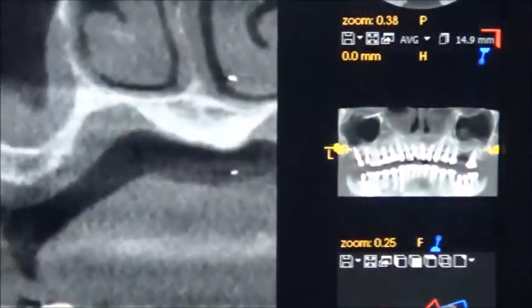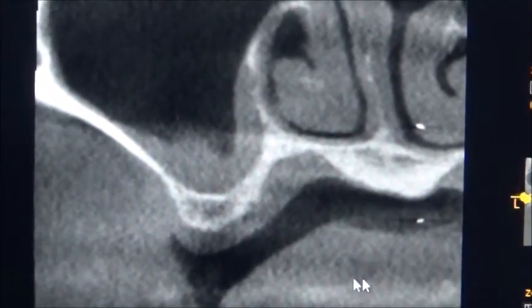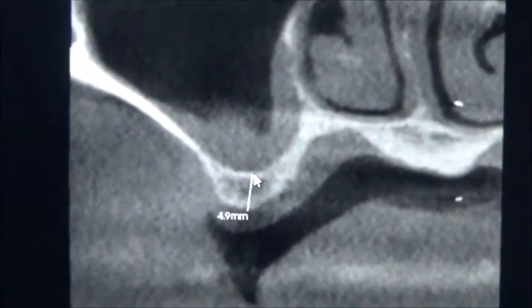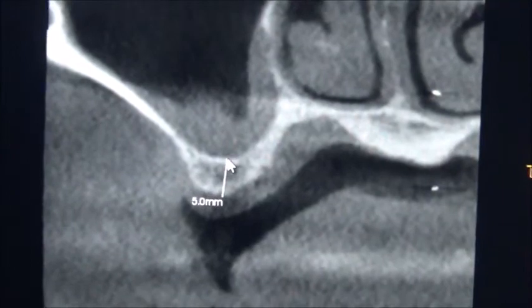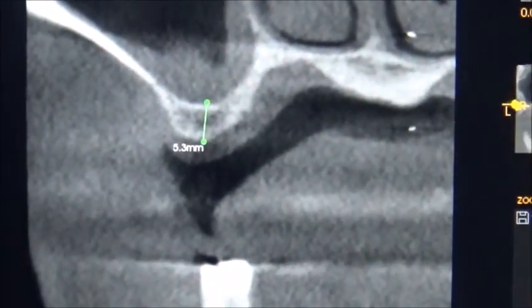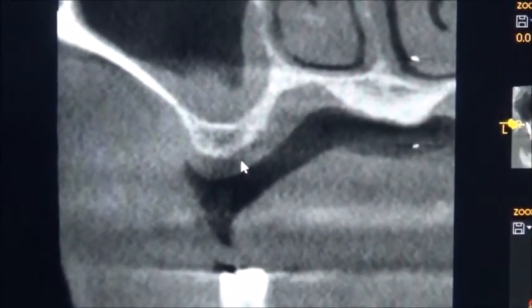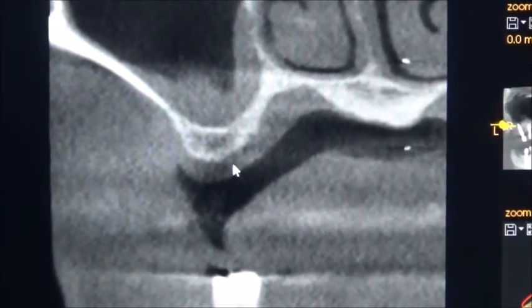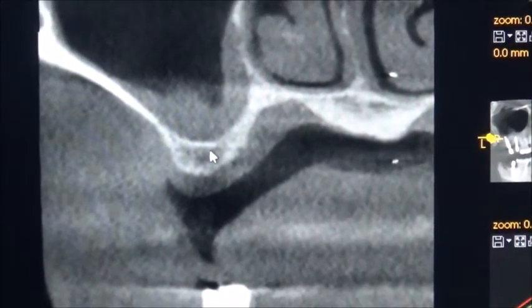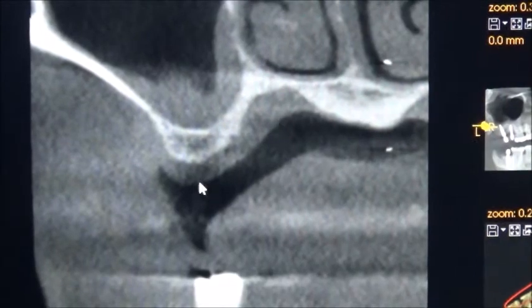Now the cross-section is in the 16 area. Very limited bone — very less, about 5mm, maybe 5 or 5.5mm. So what are the options available here? We can select the shortest length implant: Echo 6mm, 3.7 diameter, 6mm. We can place it with 1mm sinus lifting. So one option is going like this.